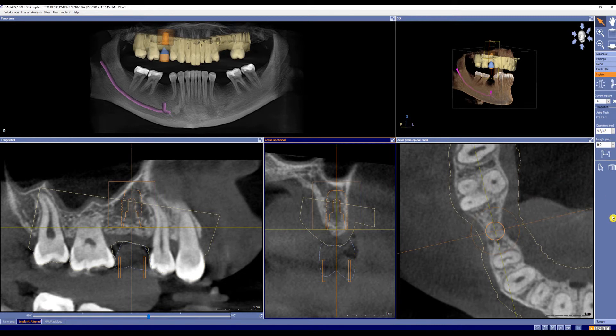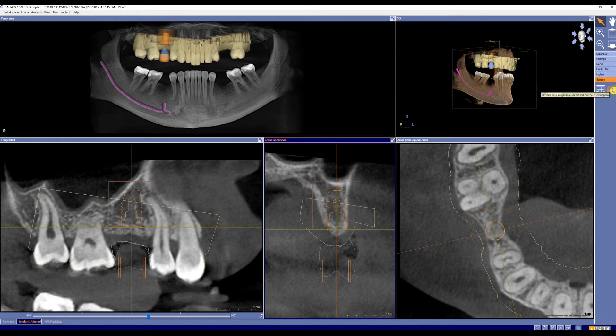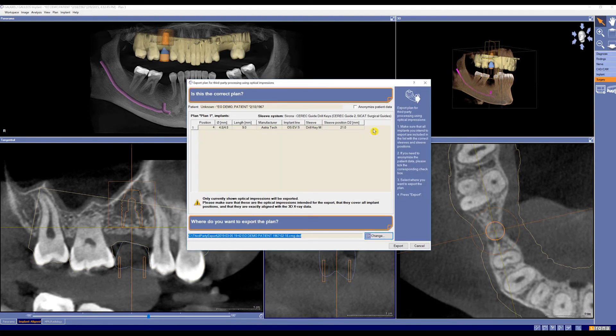From here, I can now go to our surgery tab in the bottom right-hand corner, click surgical guide, and as you can see, a new option has appeared — that's export for third party processing, which will go back into our CEREC acquisition unit to mill a CEREC Guide 2. I can click here, and you'll notice all the information that we've already planned appears. I can pick a folder that is on my server so it can be easily accessed by my CEREC unit, and click export.